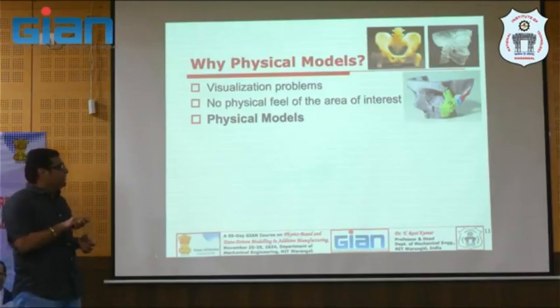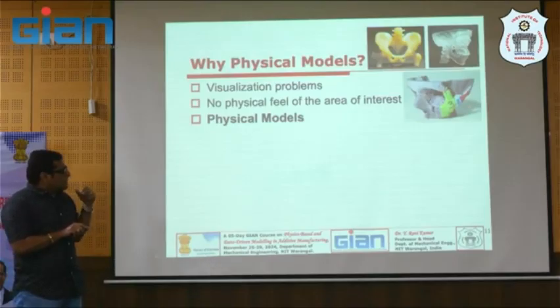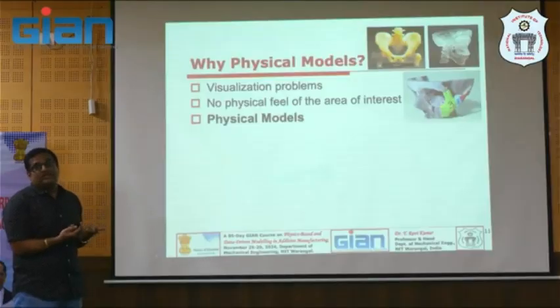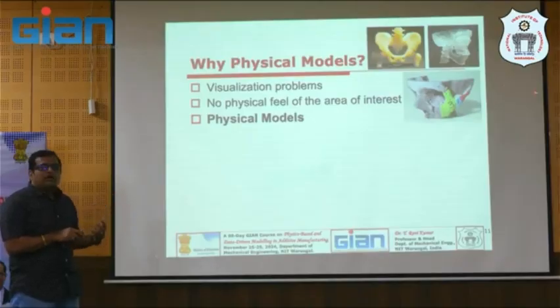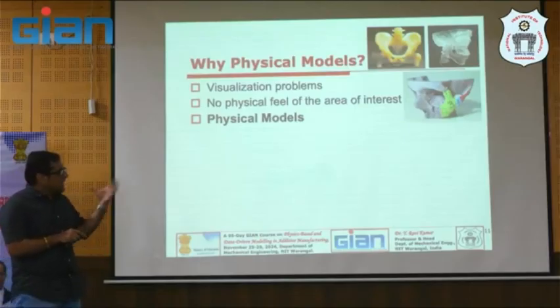Why? Because if you print this model, for example, take this reconstruction surgery, maxillofacial reconstructive surgery. This patient needs this kind of implant here at the zygomatic arch as well as this orbital rim, where your eyeball will be sitting. So at least your ophthalmologist must be involved in this surgery, and oral maxillofacial, and of course a neurosurgeon can also be part of this surgery, right? But you have multi-professional specialized people here and the patient as well. So you can have this kind of model.